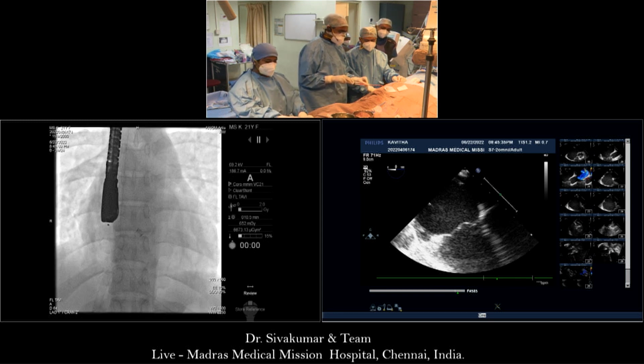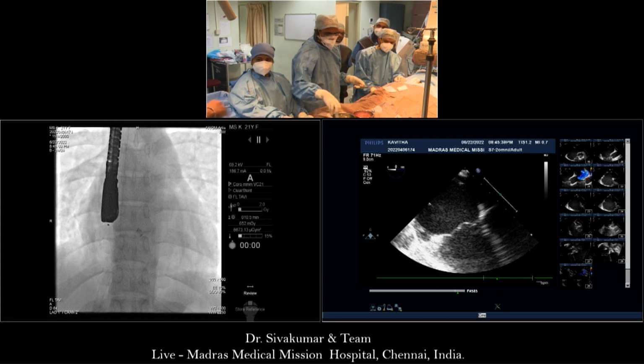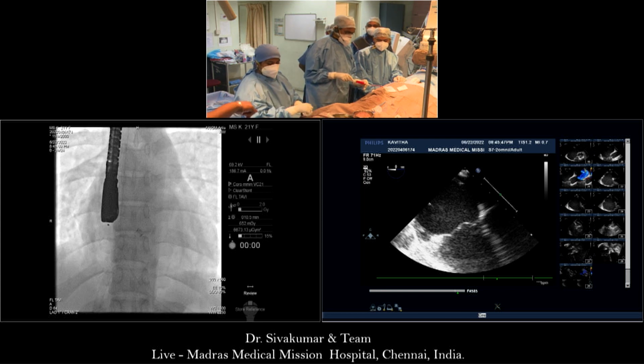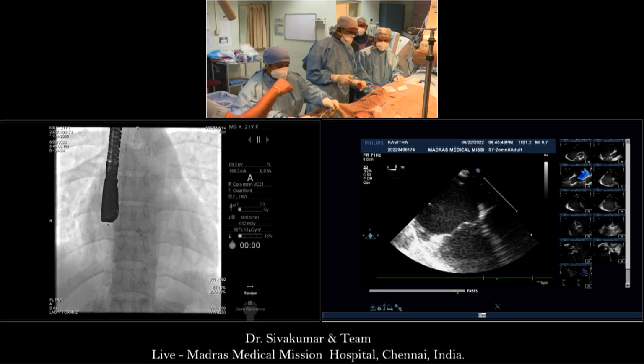That's exactly right, Siva. You've had a great educational session here. You chose a device size that has some issues with it. We've chosen a device size that's fallen out. So your issues are much more than our issues at the moment. So when you do the 40 again, do it better than the last time.